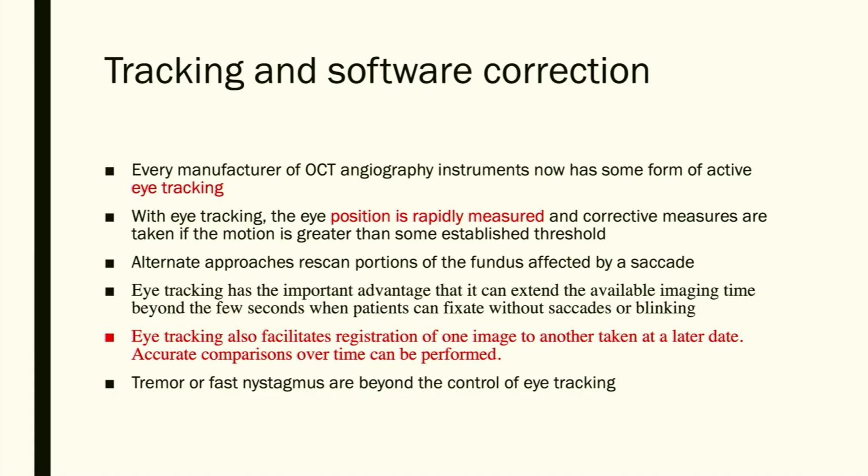The day OCT-A became commercial, it became commercial with this. So it registers whether the scan is being taken from the same place. If the patient is moved a little bit, it will move back to where you wanted it to focus.